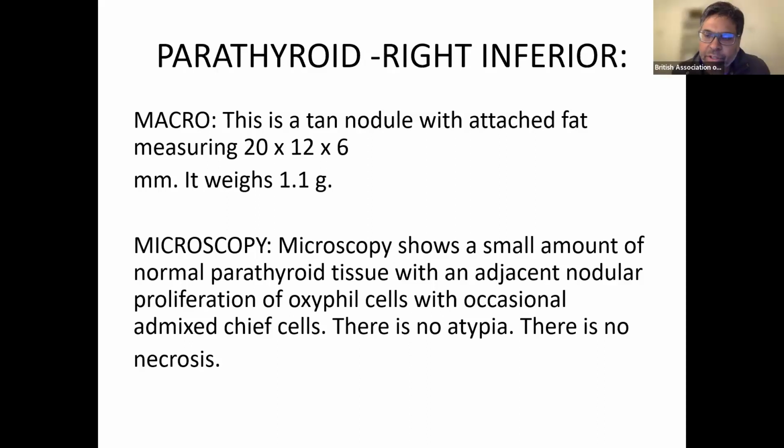So, Emma, in your practice, do you use IOPTH only for select cases, or do you use it for all of them? I use it just for select cases. And I should probably have used it in this case. I should have just held off operating until we had the machine. It was only going to be a few months before the machine was up and running. Same question for Saba and Tom. Do you use it for all your cases, or do you use it for specific cases?